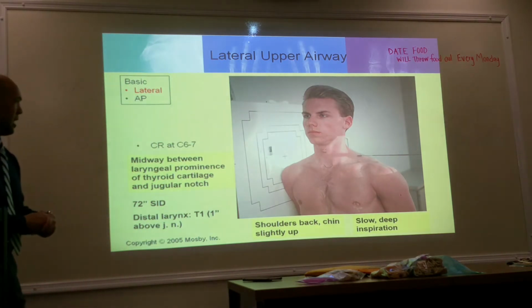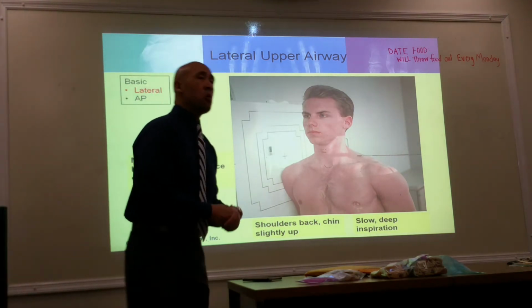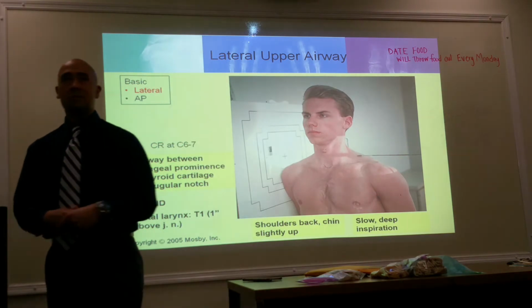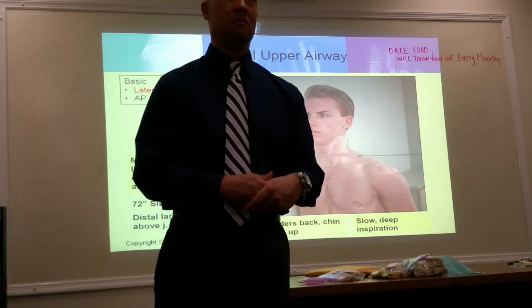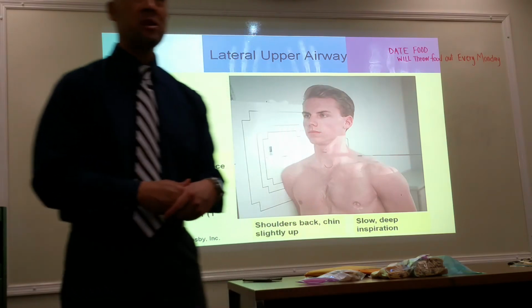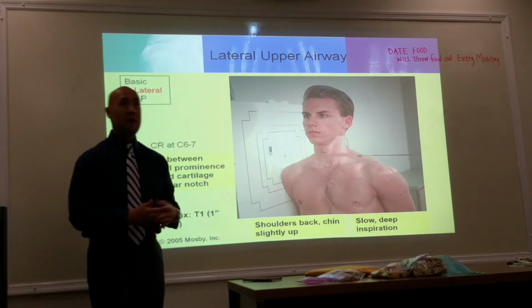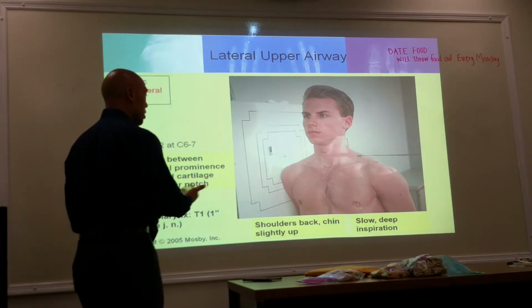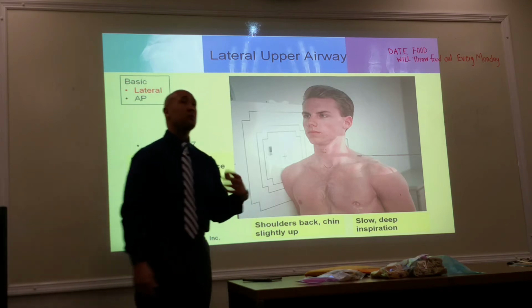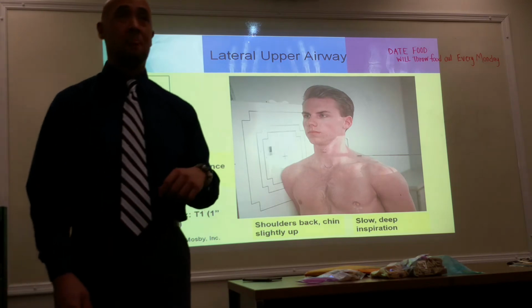Shoulders are back, chin slightly up. We are looking at the upper airway, so this will be done while the patient is breathing, because we're trying to fill the airway with air. It's slow, deep inspiration, is what the book tells you. For test purposes, yes, do slow, deep inspiration.